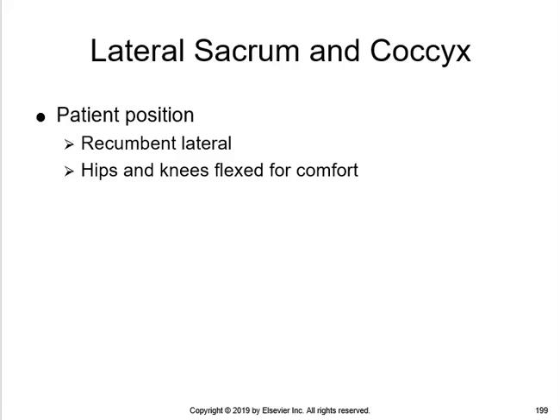In a lot of cases, when sacrum and coccyx views are ordered, they'll order both sacrum and coccyx. So you've got to shoot the APs or the PAs separately, but you can include the laterals on a single view.